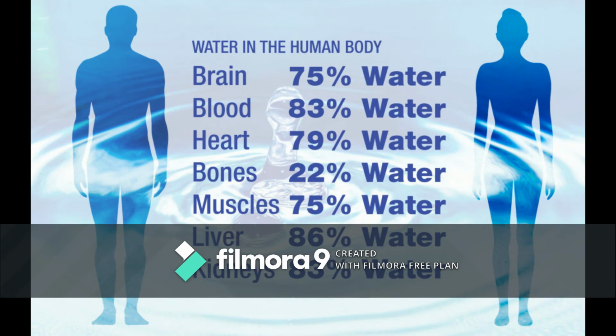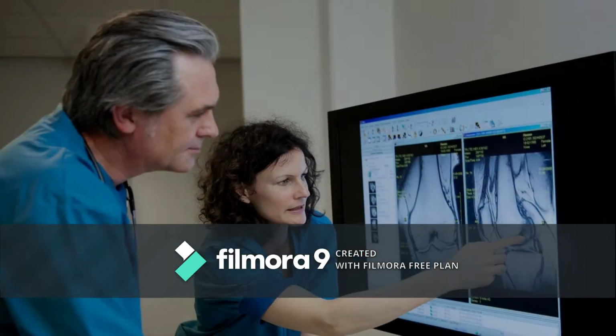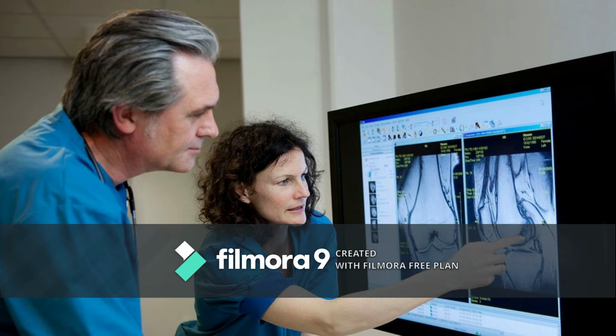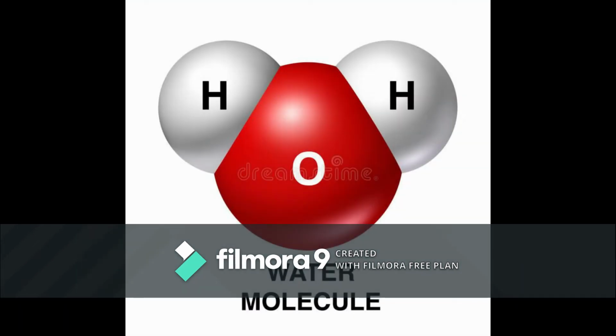Magnetic fields and radio waves are used in MRI scanners to measure the quantity of water within body tissues, map the location of the water, and then using this information, generate an image which is projected on a computer. The human body consists of an average of 65% water, meaning there is much signal to measure, allowing for the generated images to be highly detailed. The hydrogen atoms of water molecules are used in the scanning process to measure the signal from the body.